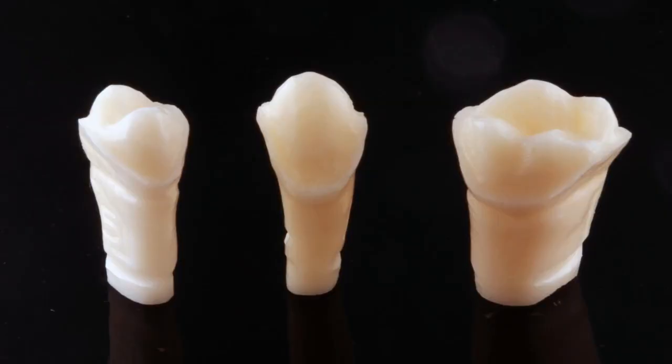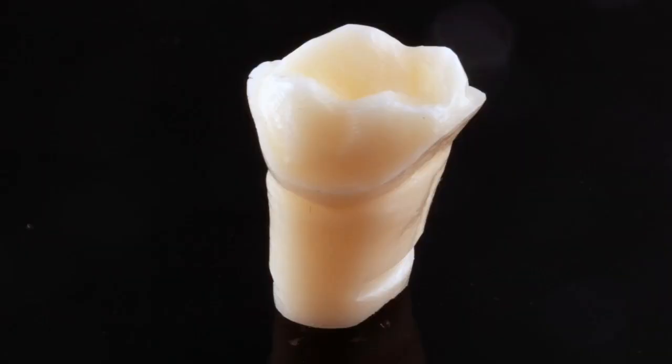These are really nice dies. They're made out of acrylic. And the models are actually really nice too. They have a nice feel to them. I usually use them as demo models or for conventions to show the work. The anterior teeth are all really nice. I'm not so much of a fan of the posteriors because the occlusal anatomy is just too busy and too deep. But what you can do is take a carbide burr and grind it down, or you just take some scanning wax, fill it up, and scan it in.